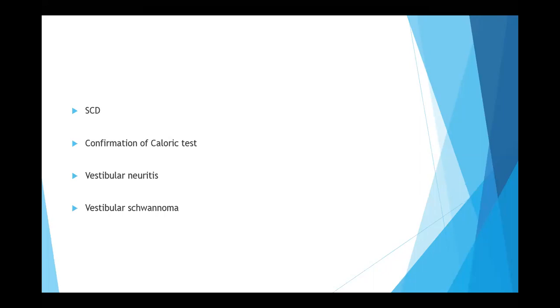So they buy only the ABR and then only the VEMP or something related to it. What if the clinic has not bought the VEMP protocol, they don't have VEMP with them, and they have only ABR?